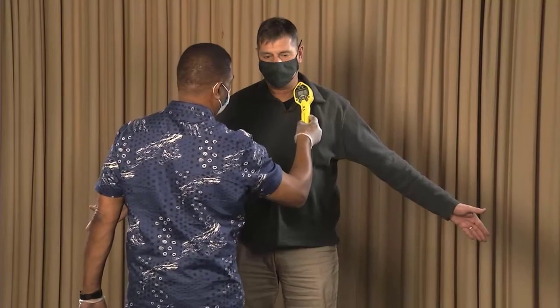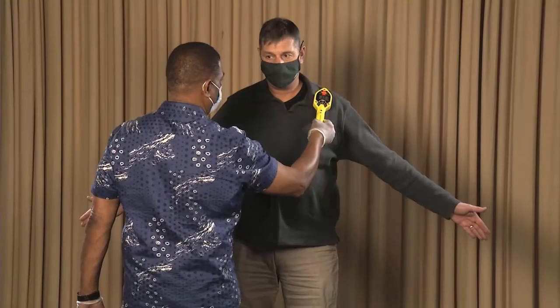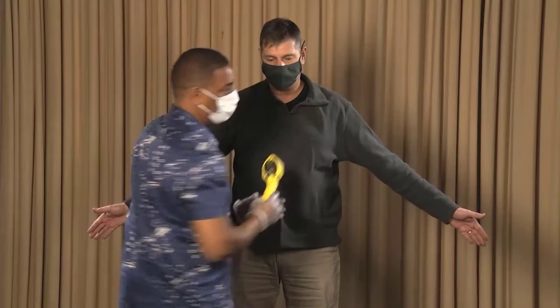Periodically pause when surveying the face, neck, hands, and feet to listen for an increase in the audible clicks, and pause if one occurs. Document all readings greater than two times background.